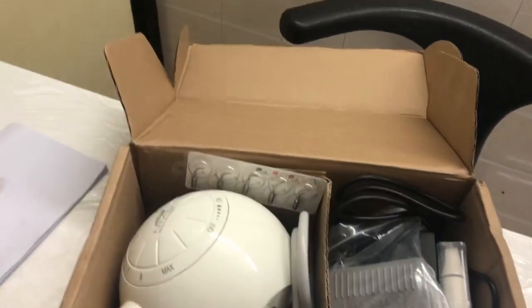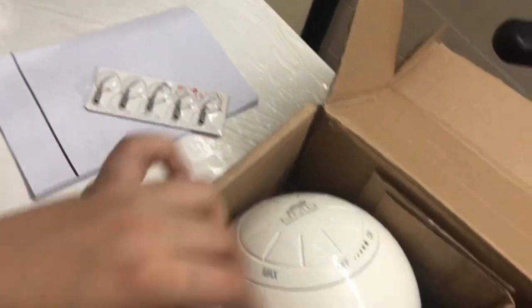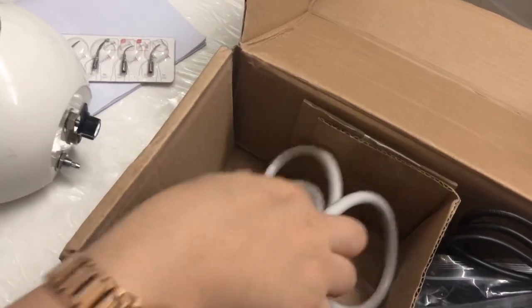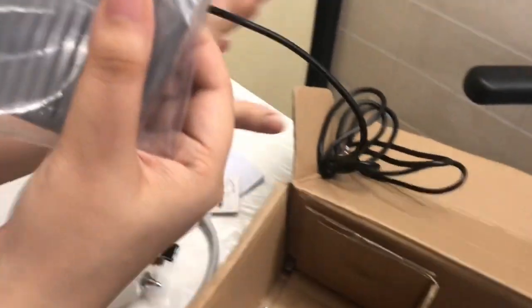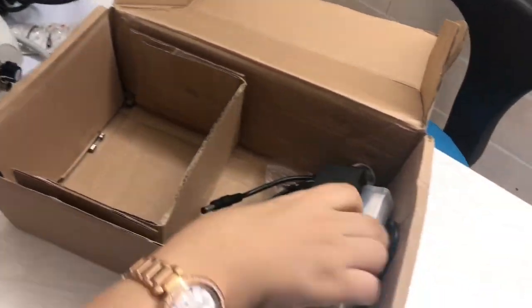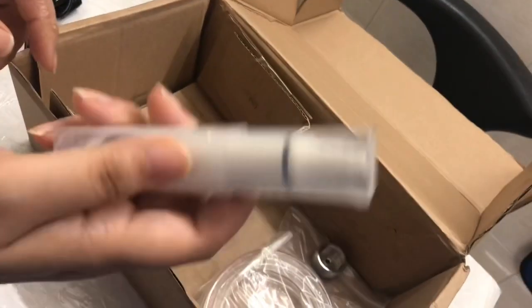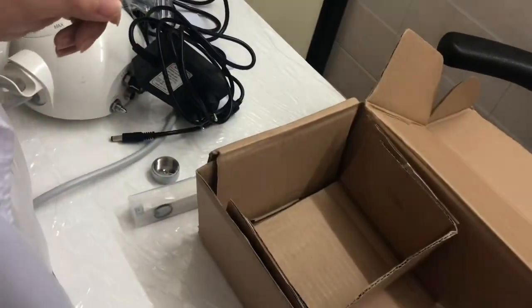We have this one manual. We have these Scalar Tips and we have this machine — the Scalar Machine. Let me show you what the parts are inside: we have two switches, one adapter, these are Scalar Handpieces, a Wrench, and a Water Pipe.